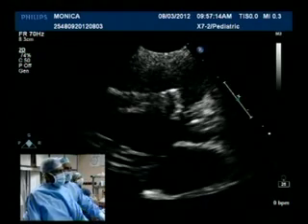For those of you who are not familiar with the history of perimembranous devices, it has gone through quite a turbulent period. Initially, we started with what is known as an asymmetrical device, wherein the whole problem in perimembranous devices is its proximity to the aortic valve and the chance that it might impinge on the conduction system. The asymmetrical device had become unpopular. There are many centers which have given up doing asymmetrical VSD devices because it is estimated that 5% of cases would develop complete heart block. And the worrying aspect of this whole thing is that patients develop complete heart block 2 or 3 years later, which is completely unpredictable.